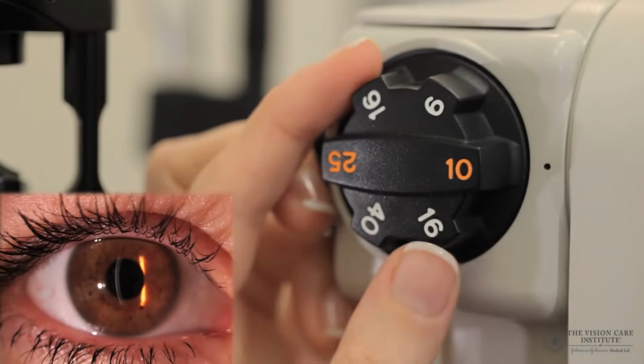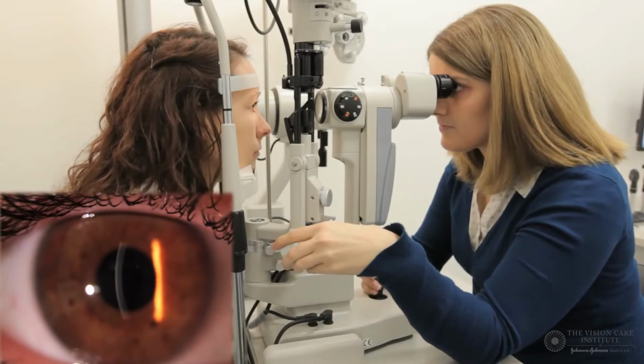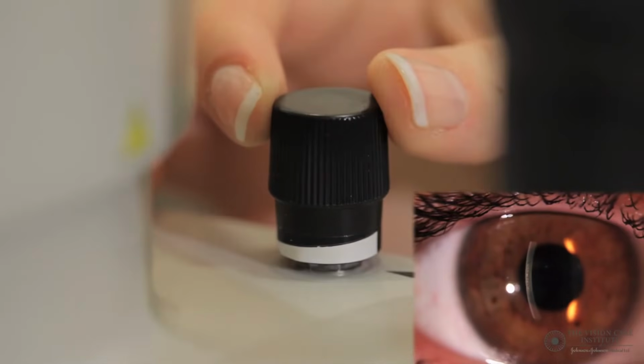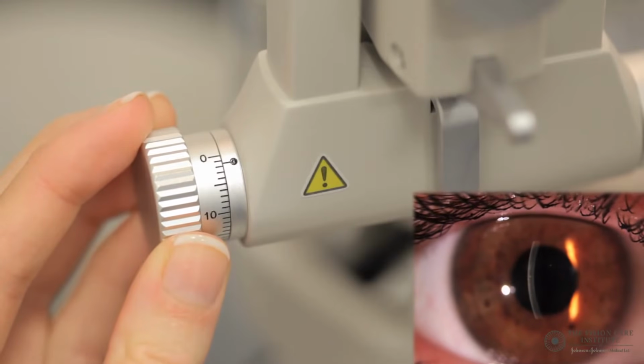We can now magnify the image further, whilst carefully focusing it and ensuring we turn the brightness up as much as possible as we have a thin slit. The slit width might need to be adjusted to get a bright image whilst maintaining the clarity.